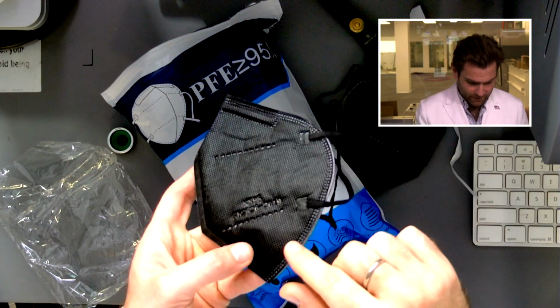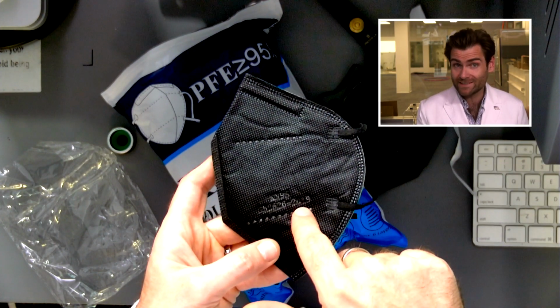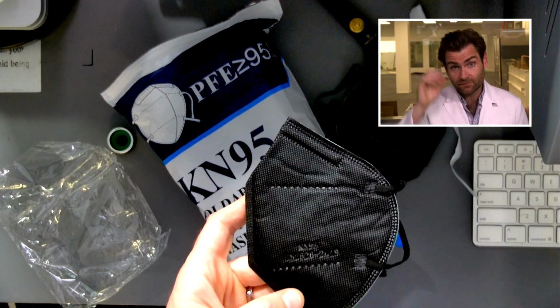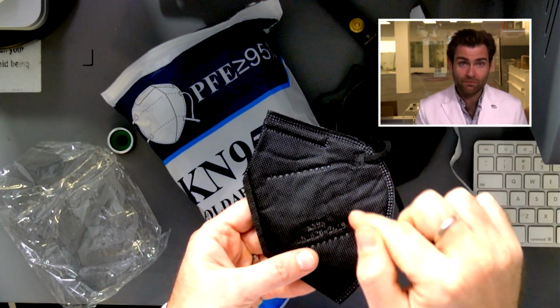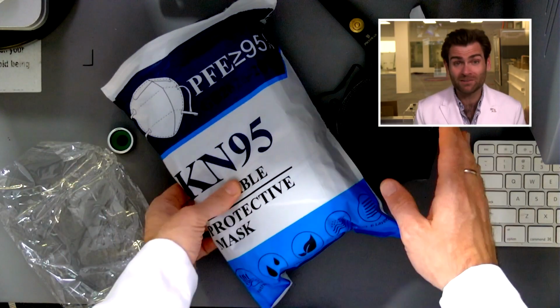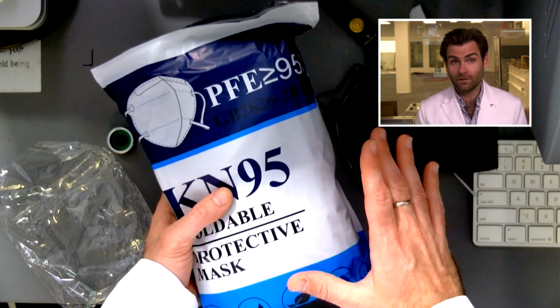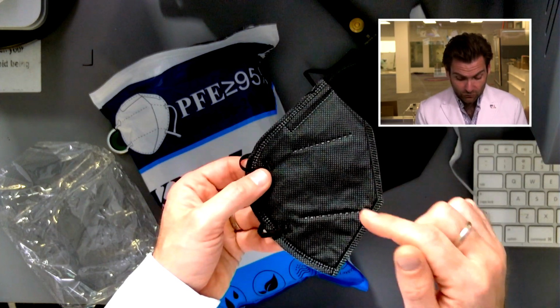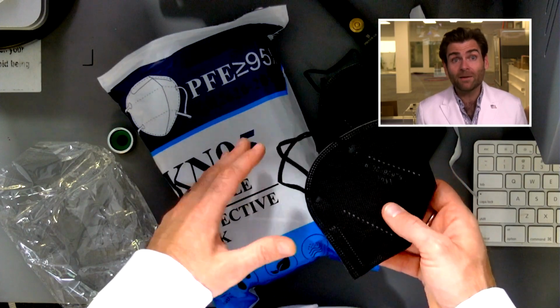Now, I can tell you, just looking at the mask, this is not a KN95, not a legitimate one anyway. It says KN95, and it says GB 2626-2019, which is the Chinese executive standard that it's being held by. But part of that standard is that you have to put the manufacturer's name on the actual thing here. What happens often is you buy something on Amazon and something totally generic shows up. And that's why a lot of manufacturers do not put their name on it, so that they can sell it to a bunch of different brands. That's what's happening here.